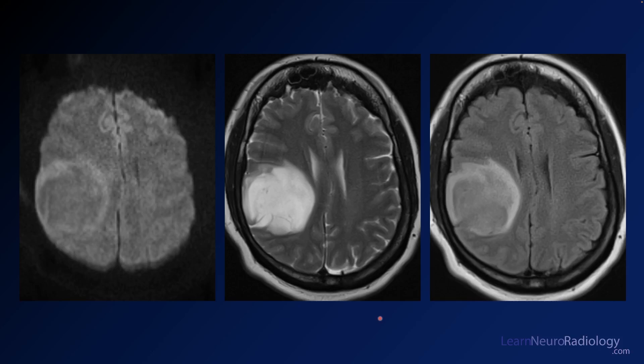Here we have some axial images from an MRI of the brain. On the left, you have a diffusion. In the middle, you have a T2. On the right, you have a FLAIR. Take a look at the abnormality that you're seeing there and formulate in your mind what you think that might be.